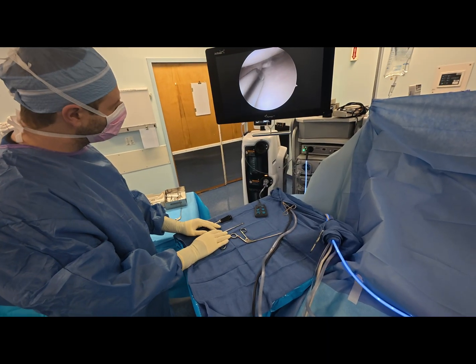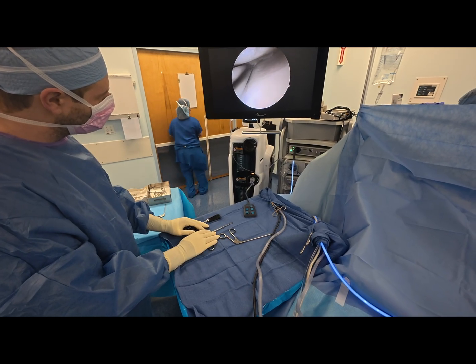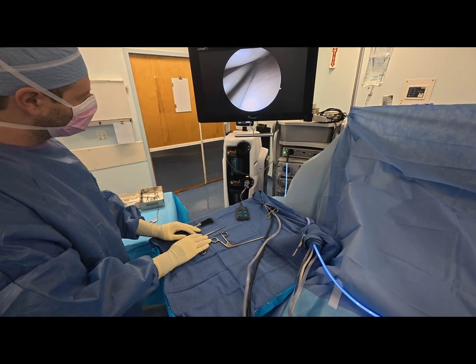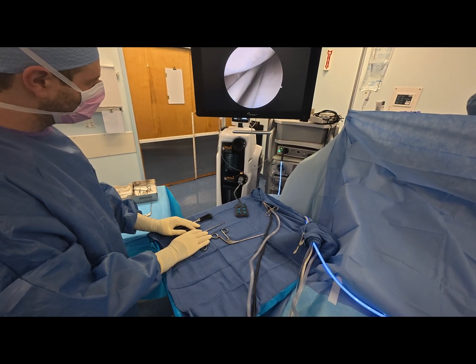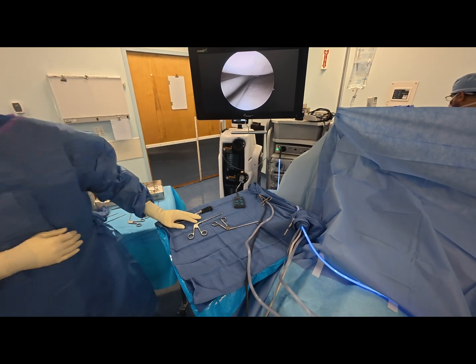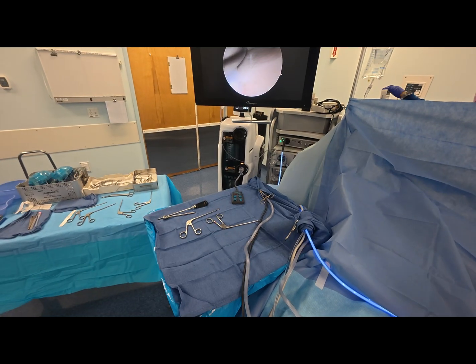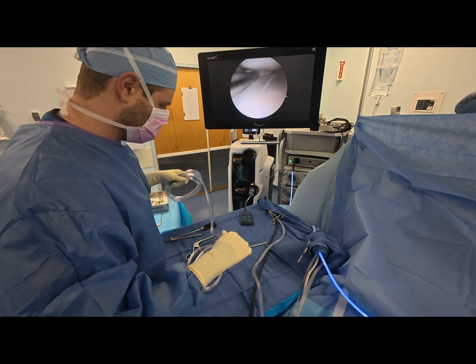You can see a flap of the meniscus. Now you can see I'm getting underneath that medial femoral condyle without causing any articular damage. Now you can see a little flap right there. See it? You'll see it pop out in a minute, right there.